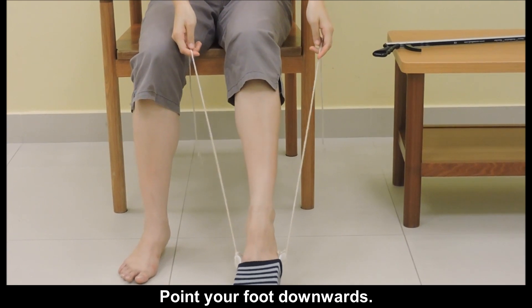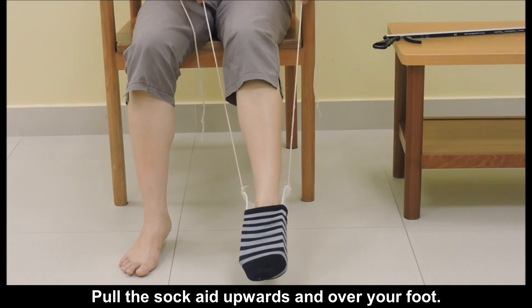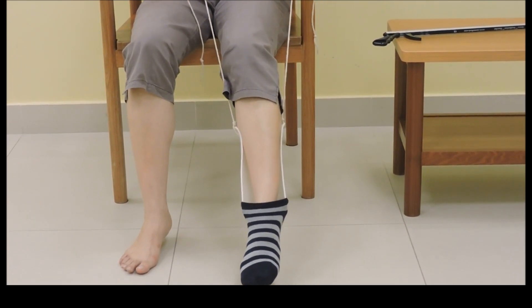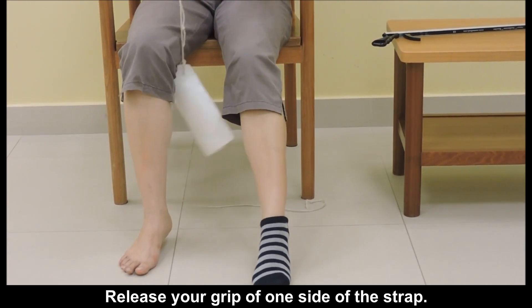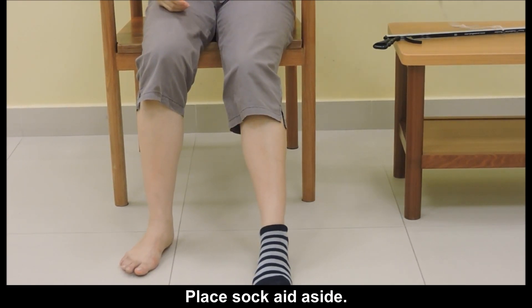Point your foot downwards. Pull the sock aid upwards and over your foot. Release your grip of one side of the strap, then place the sock aid aside.